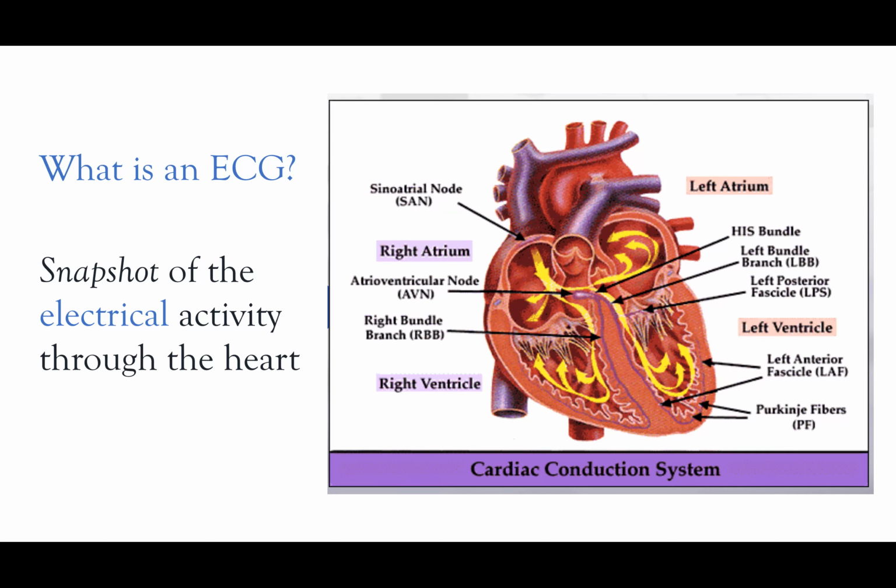Of course, ECG, many of you who are coming from Europe and elsewhere, ECG sounds normal to you. Here in the US, we often call it an EKG. The K just comes from the German spelling of an electrocardiogram, cardio spelled with a K, and that made its way back into the English language. But in most of the world, it's known as an ECG, an electrocardiogram.